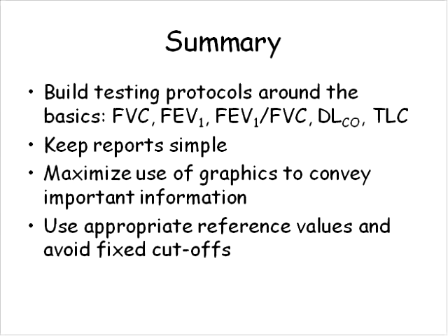That's a topic that comes up quite often. One of the ATS guidelines suggested that you could administer the bronchodilator while the patient is bronchodilating, then go ahead and measure diffusing capacity. However, the diffusing capacity guideline didn't really mention that. So there's some discussion as to whether or not it's appropriate to do spirometry and lung volumes, then administer a bronchodilator, and then while the patient is bronchodilating to do tests like the DLCO. Some labs have chosen to do that.